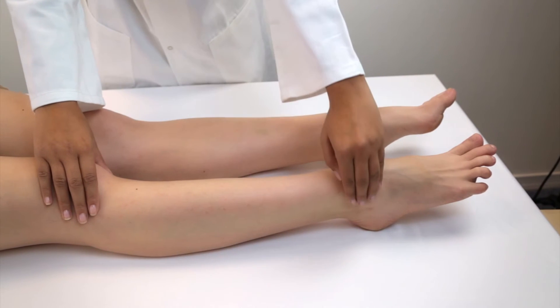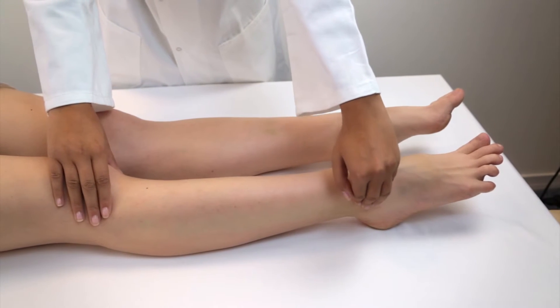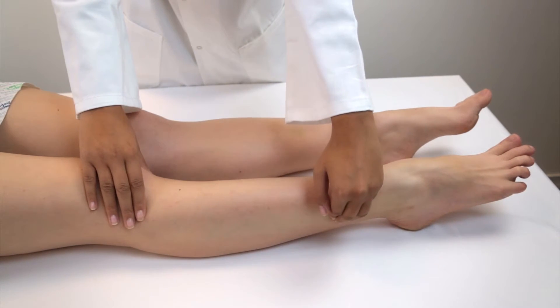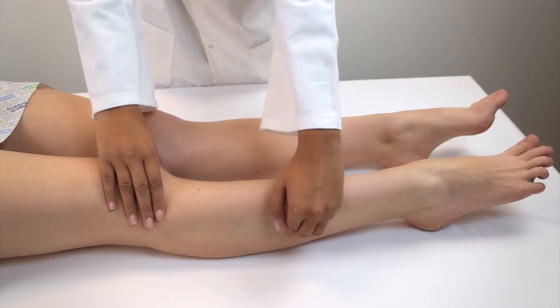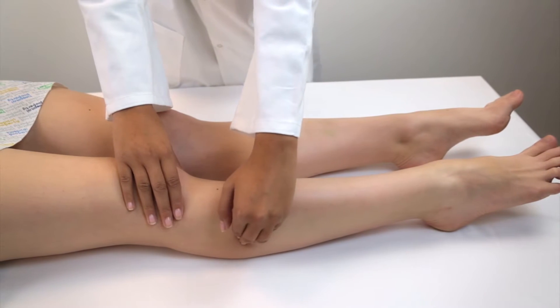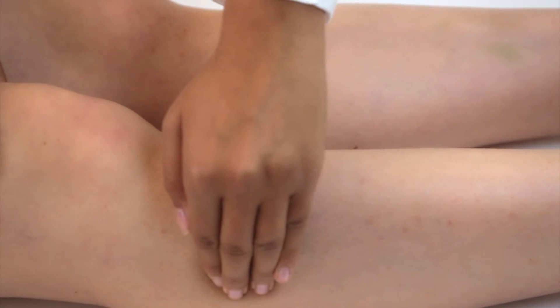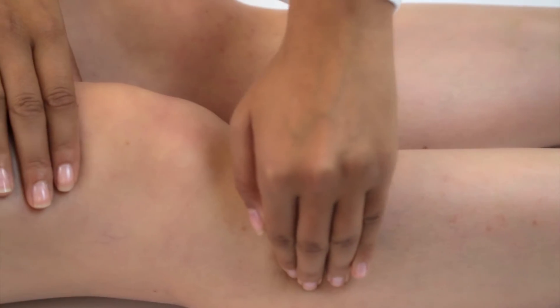Alternatively, locate the fibular head by placing your fingers on the ankle bone, on the outside of the leg, and in the groove between the calf muscles and the muscles at the front of the leg. Run your fingers upwards towards the knee until you feel the round protrusion at the top of the fibular bone — the fibular head.